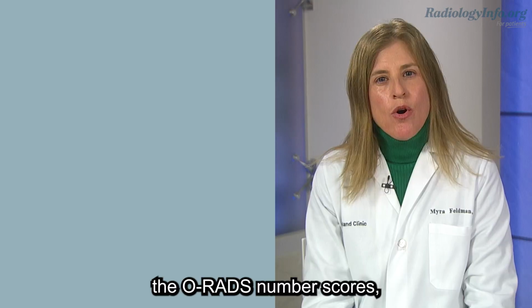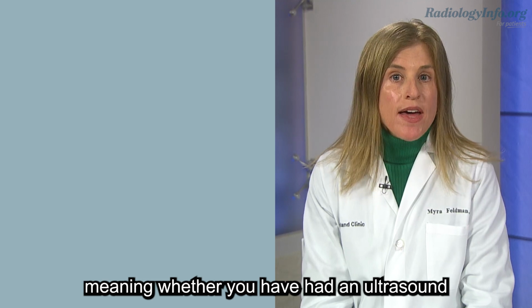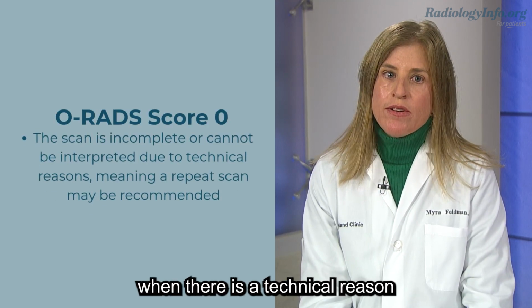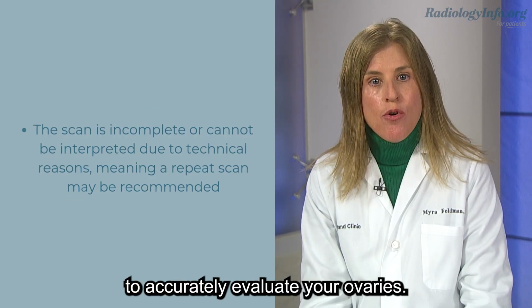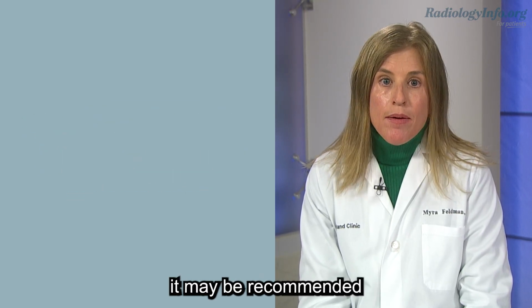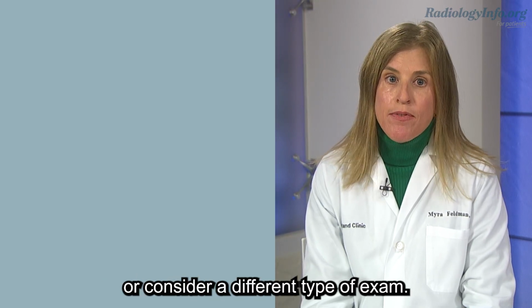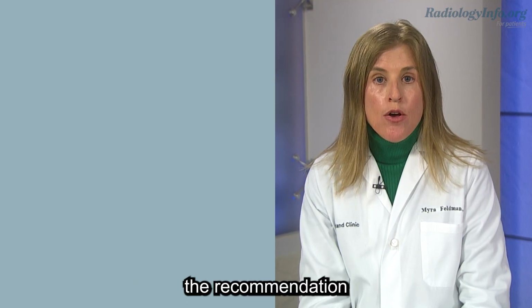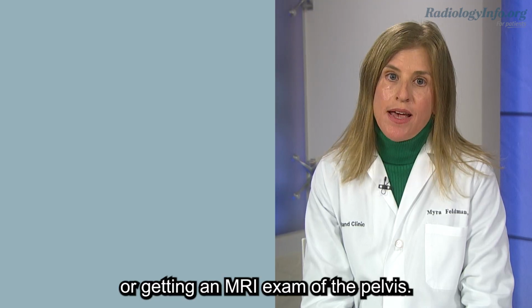Now, before we review O-RADS number scores, let me start by saying that scores of 0 to 3 have a similar meaning whether you have had an ultrasound or an MRI exam. A score of 0 is given when there is a technical reason that does not allow the radiologist to accurately evaluate your ovaries. In your report, it may be recommended that you repeat the exam on another day or consider a different type of exam. For example, if you had an ultrasound which was given a score of 0, the recommendation may be repeating the ultrasound or getting an MRI exam of the pelvis.